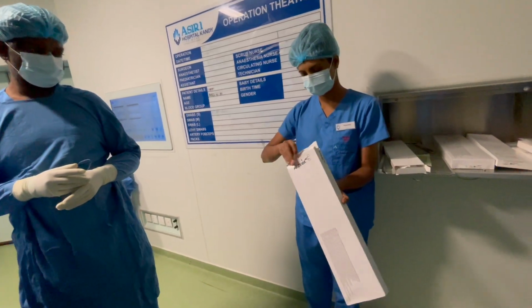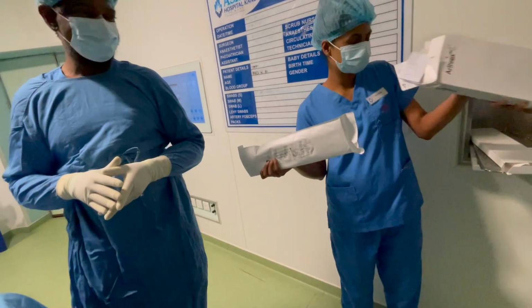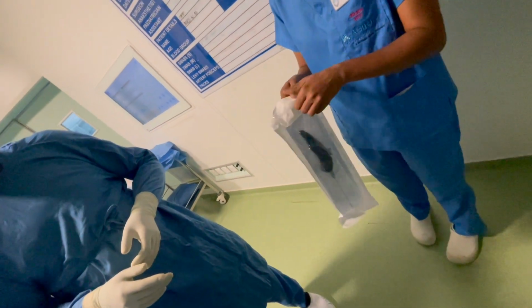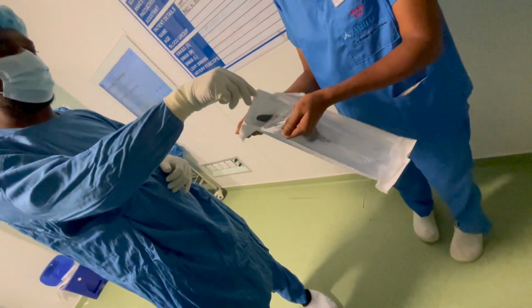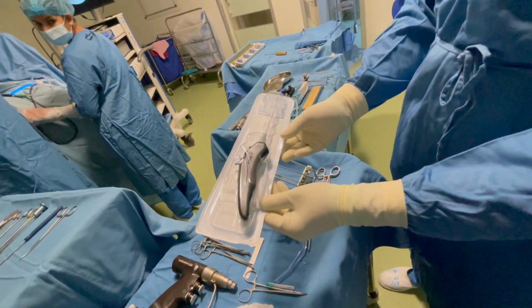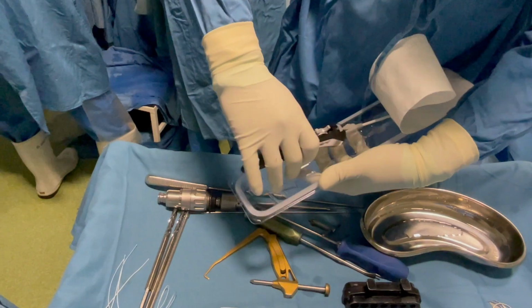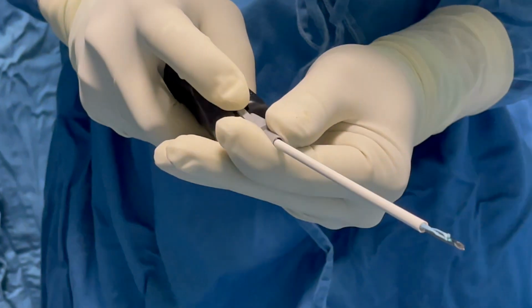Anchor sutures are a widely used technique. Procedure. Repairing a meniscal tear using anchor sutures is typically performed arthroscopically, which is a minimally invasive surgical technique. Arthroscopic access. Small incisions, portals, are made around the knee joint. The surgeon inserts an arthroscope, a thin, flexible tube with a camera on the end, through one of these incisions to visualize the inside of the knee.